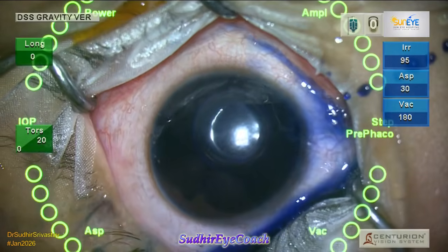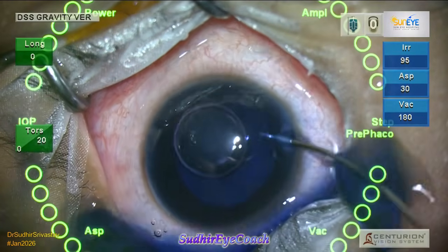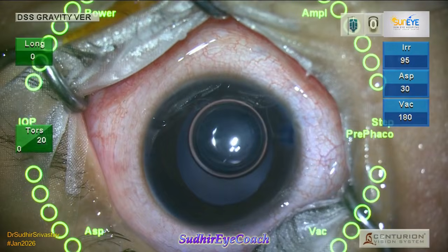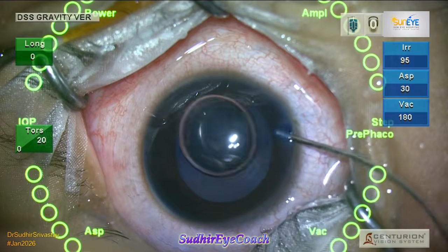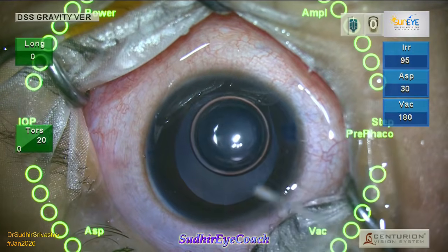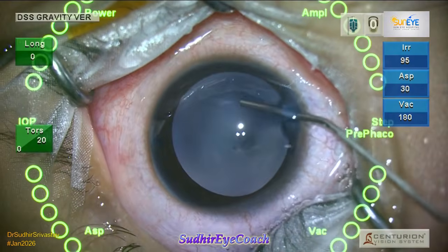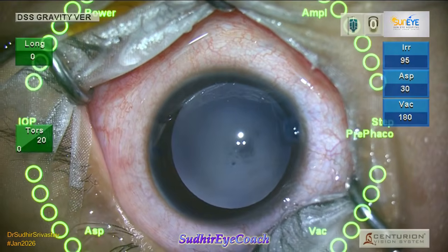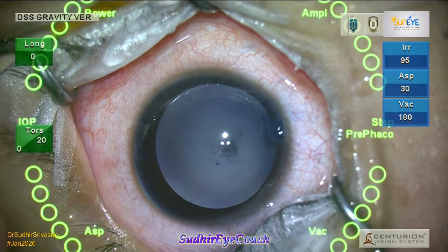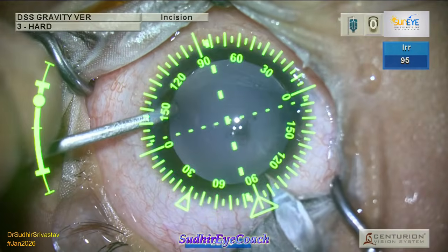Pediatric cataract surgery is entirely different from adult cases and demands meticulous planning, precise execution, and special attention to long-term outcomes. In this video, I'll be highlighting a few important practical tips and key points while dealing with such pediatric cases, which I believe will be helpful for young ophthalmologists and surgeons undergoing phacotraining.